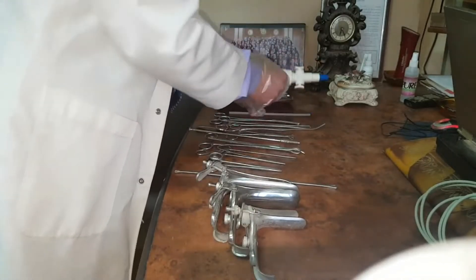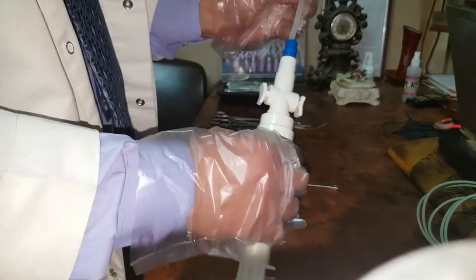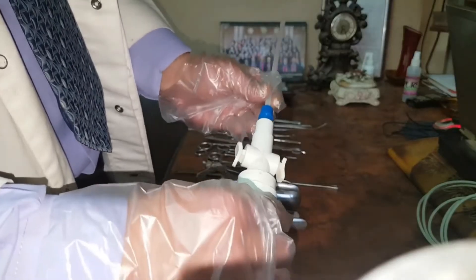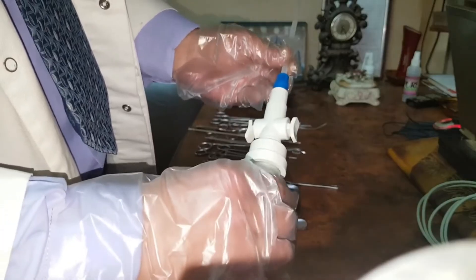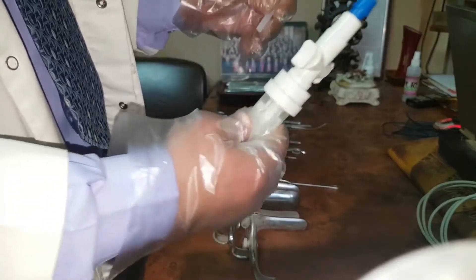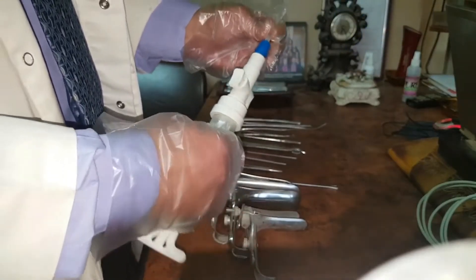This is called MVA, or Manual Vacuum Aspiration. It is used to evacuate the uterine content in case of incomplete abortion or missed abortion, and also to take an endometrial sample.